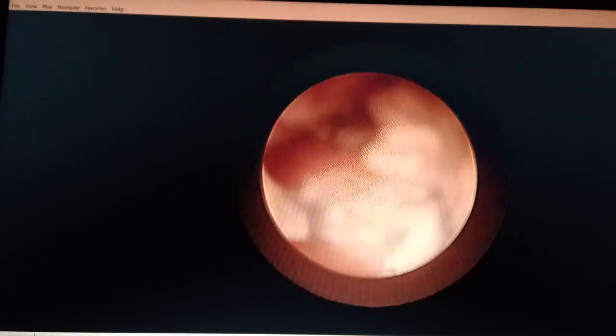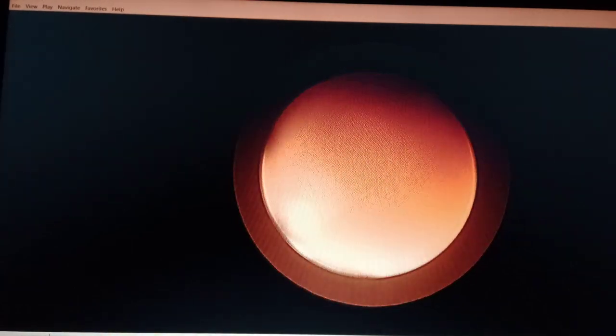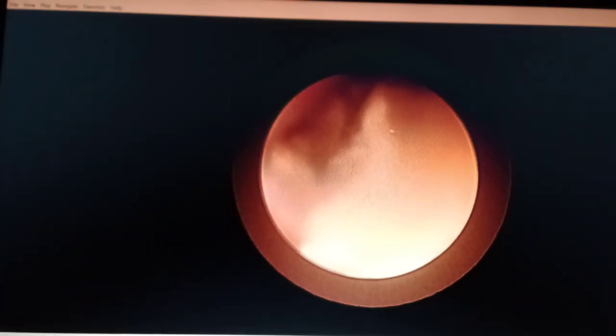Although it is difficult to trace the ureteric opening with URS without a guide wire, your previous cystoscopy findings, the images processed by your cortex, and your hand-eye coordination along with experience will help you to directly spot that opening. Here we have slightly entered the left ureter-vesicle opening, just doing the inspection through the ureteroscope. This one is the opening and these are the fragments of stones.